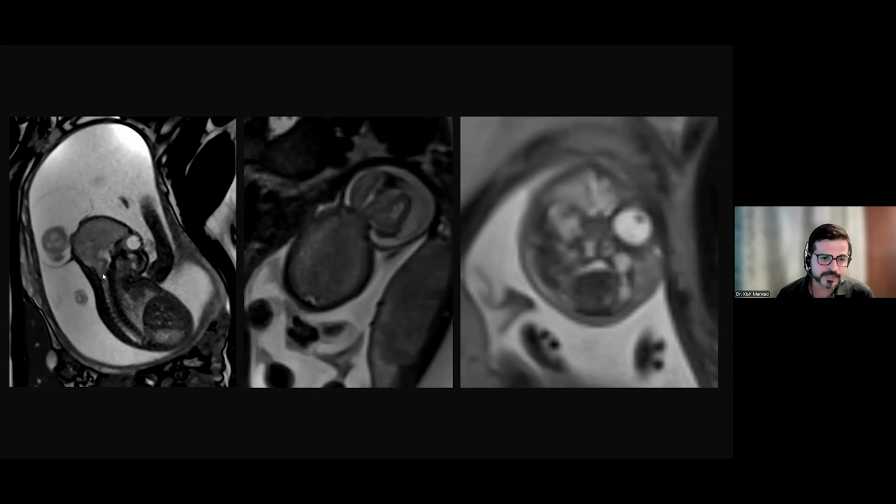You look at the brainstem. Some people call it the S shape. Some people call it the Z shape. You can call it whatever shape. It's abnormal. And then, of course, it's harder to comment on what's happening with the cortex. Apropos to the gestational age, this cortex looks abnormal, at least to start with. And then you go back to the eye, and definitely there's a problem with one of the eyes here, the other looking a little bit less remarkable, but there is a problem on one side.